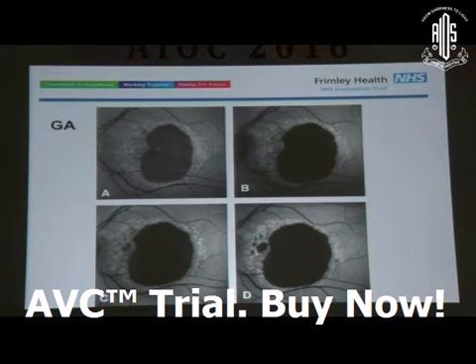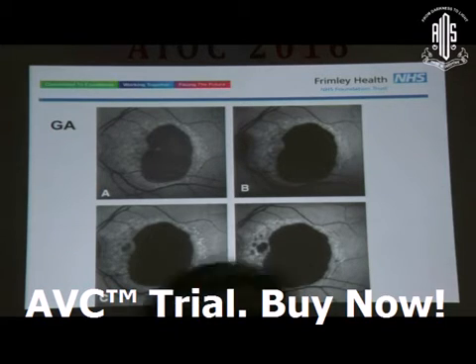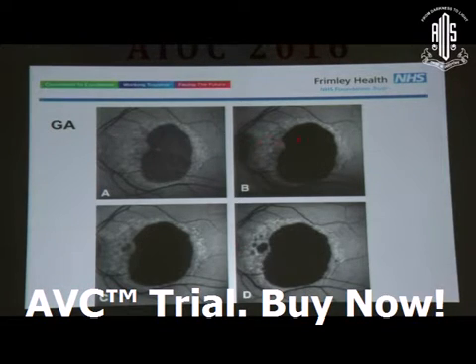So here, this is what I'm trying to show you. This is a patient who has been followed up. If you look at this, there's autofluorescence just nasally as compared to the temporal and the superior and inferior margins. And by the third year, you can see that the area nasally has started atrophying, in addition to the fact that the central area has already enlarged. So this tells you how the geographic atrophy is going to progress.